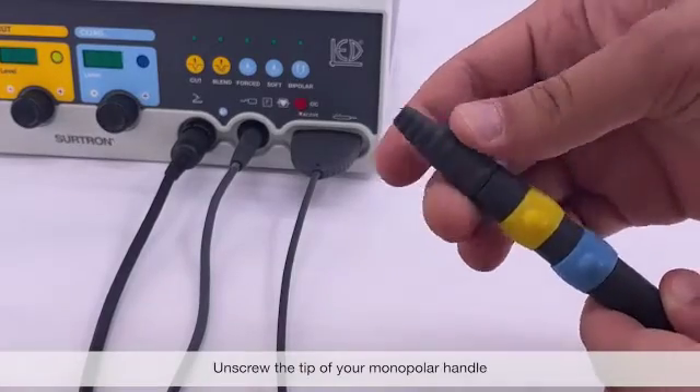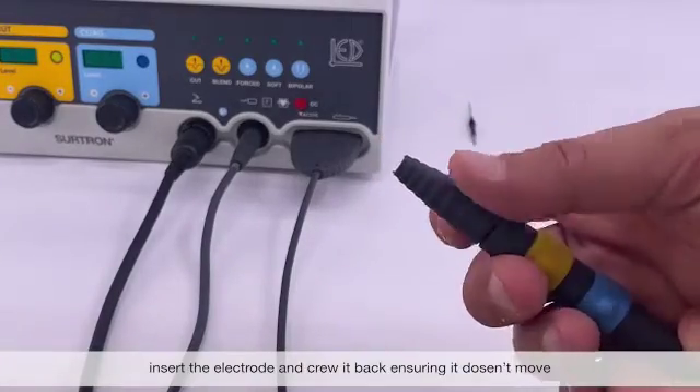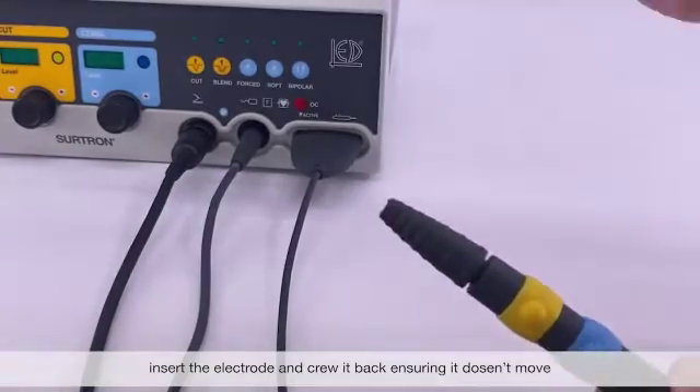Unscrew the tip of your monopolar handle, insert the electrode, and screw it back into place, ensuring it doesn't move.